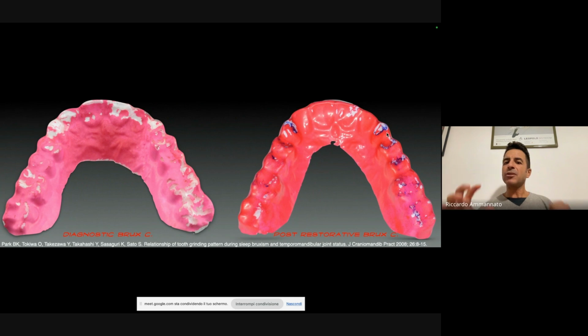And you see we have a superimposition of the blue, that is the movements, the static and the dynamic in the clinic, and the white, that is the static and the dynamic overnight. And you see there are a few things that I don't like. I have on my composite here, he's going in this situation overnight, but no blue here, so he's not going there when he's in the dental chair.